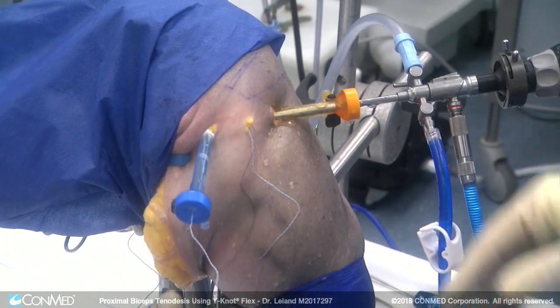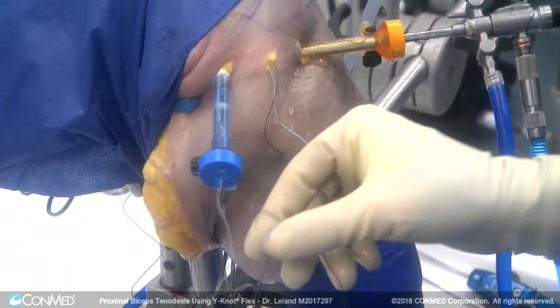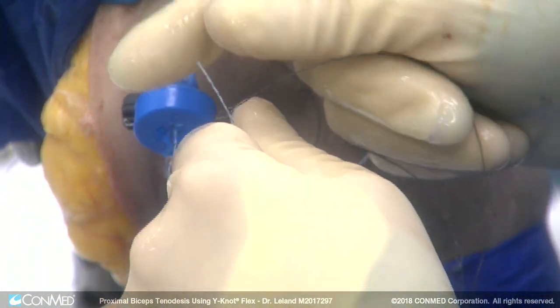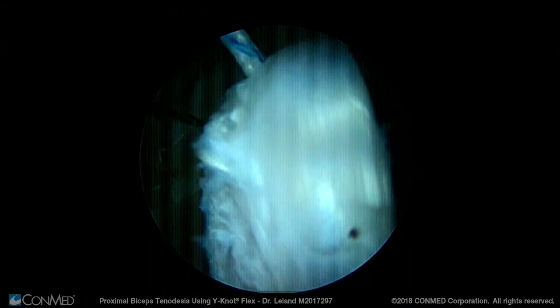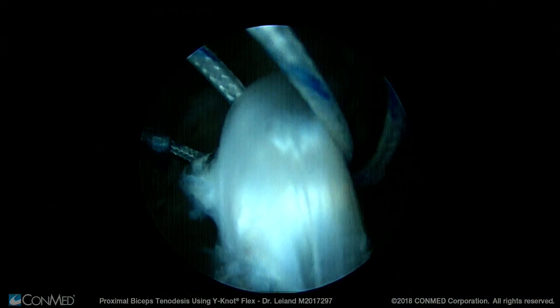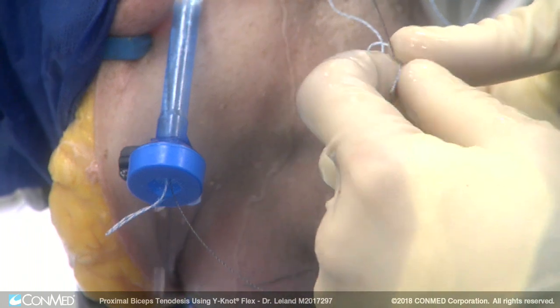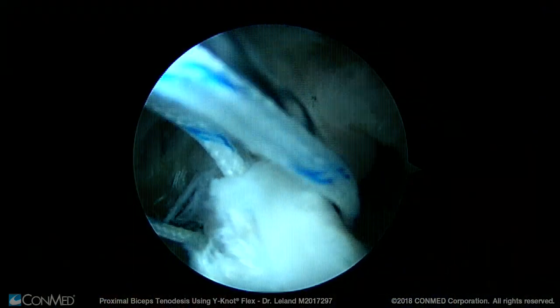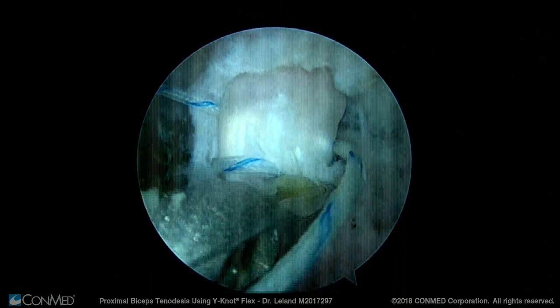Now we use the Super Shuttle to pass the sutures around underneath the biceps tendon. One limb of the suture coming out of the anterior portal is passed through the central hole of the Super Shuttle. It's important to use the central hole to keep the Super Shuttle in place for passage of the other suture. The first suture is passed around, making sure the Super Shuttle is not pulled all the way through the anterior portal. The central hole is then used again to pass the other limb around the biceps tendon in the other direction. The Super Shuttle is pulled out, and the sutures are wrapped around the biceps tendon.